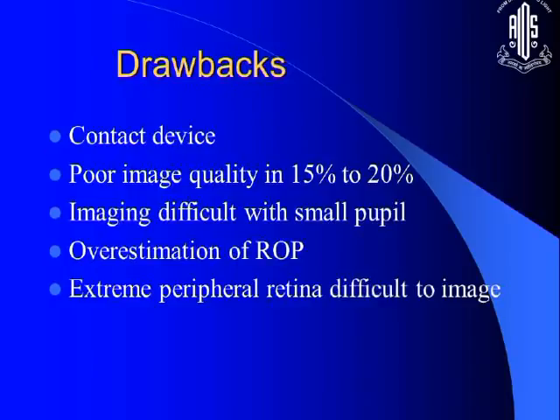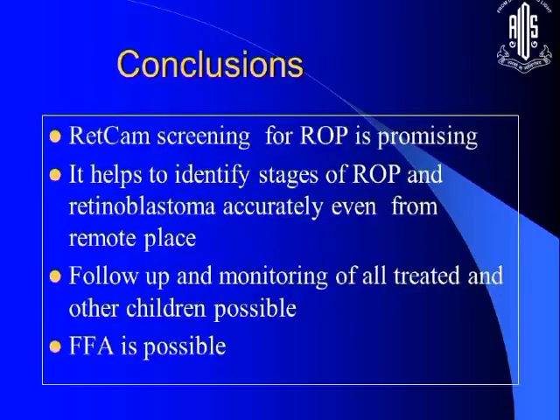The problem is it's a contact device, you have to put it on the eye, that is a little bit of a disadvantage. Sometimes you might have poor quality image in 15 to 20% due to small pupil, and of course sometimes you may overestimate ROP because of these reasons. Otherwise it might at times be a challenge if the pupil is not dilating well to look at the extreme periphery. So RetCam is a great tool.